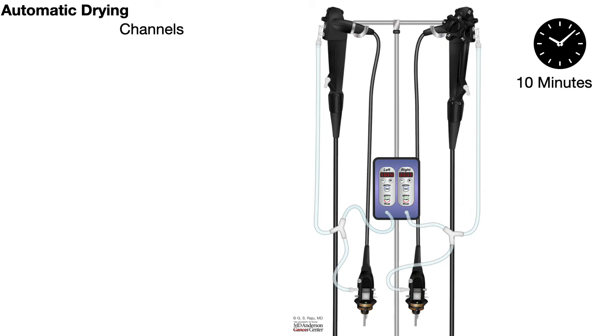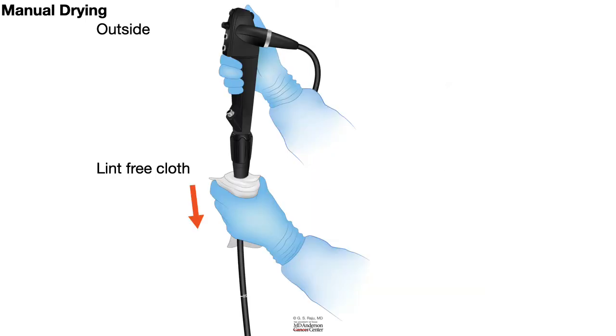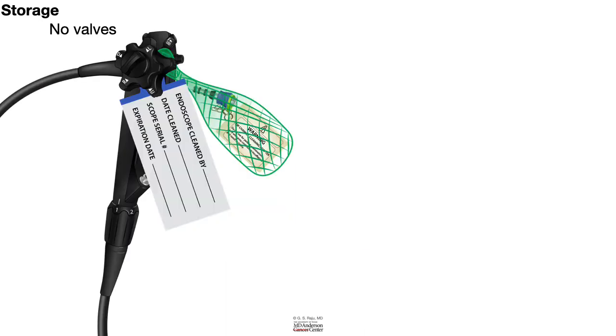Irrespective of whether we use manual drying or automatic drying, after finishing 10 minutes of drying, we take a lint-free cloth to dry the exterior of the scope thoroughly. Then you hang on the label and other attachments to the scope.